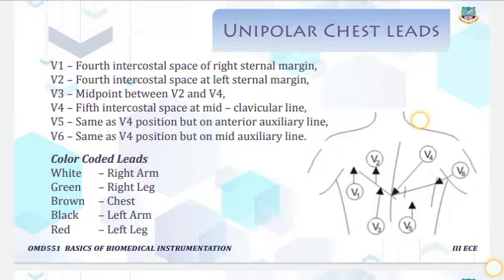This is known as the Wilson lead system, and the electrocardiogram is recorded for the 12 lead system. Okay. So here, this V1.